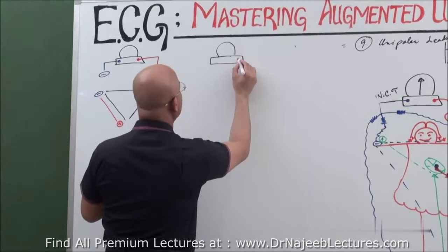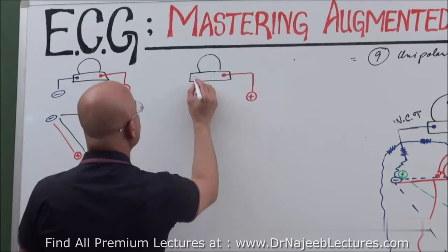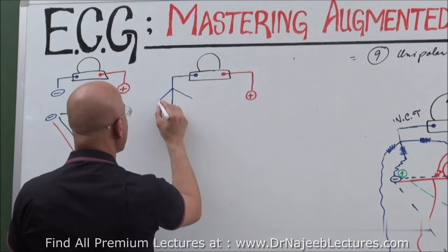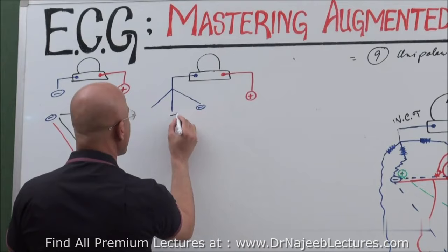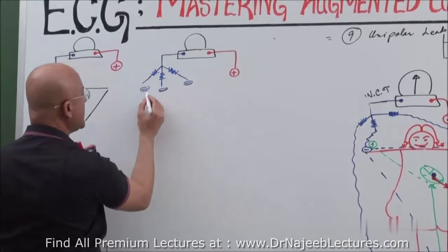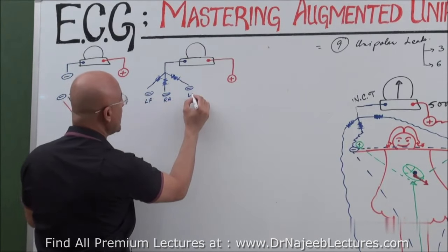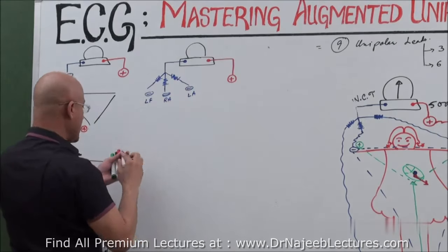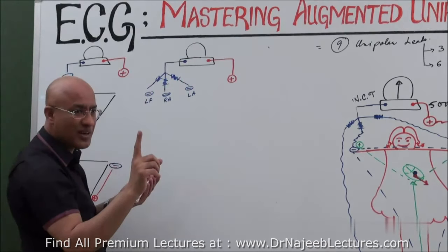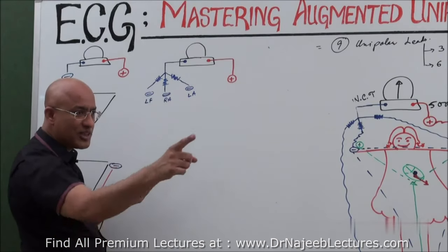Yes. In the Wilson system, what is the electrode arrangement? Positive electrode and, yes, with 5000 ohm, and this is, suppose, left foot, this is right arm and left arm. What is this now? Wilson common terminal. Converting the negative electrode into an indifferent electrode, placing the indifferent electrode in the center of the heart at near zero potential.